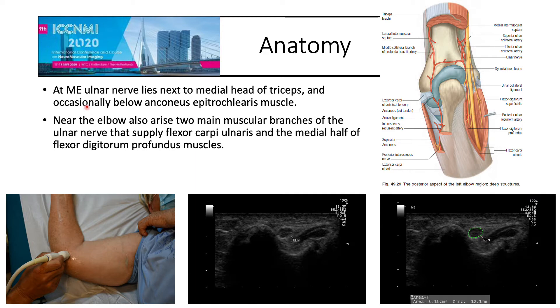At the medial epicondyle, the ulnar nerve lies next to the medial head of triceps and occasionally below the anconeus epitrochlearis muscle, which can be seen in this proportion of patients. Near the elbow also arise the two main muscular branches of the ulnar nerve, supplying the flexor carpi ulnaris and the medial half of the flexor digitorum profundus muscles. This is the medial epicondyle, this is the triceps muscle, this is the ulnar nerve, and this is where we typically measure the cross-sectional area.